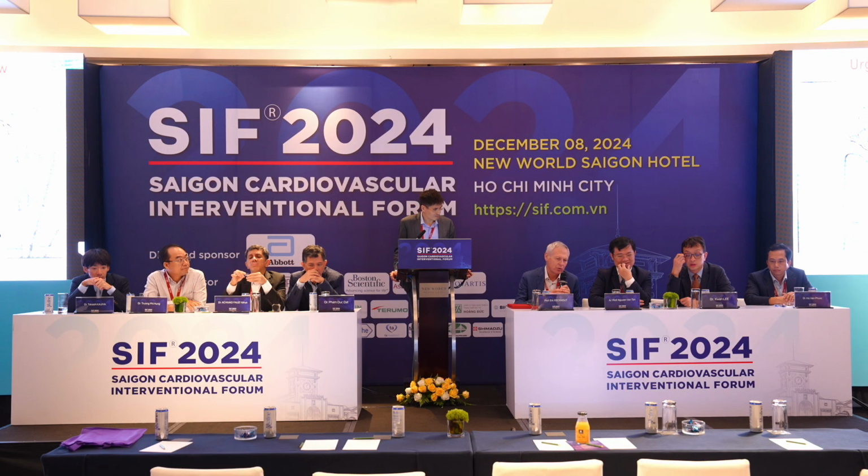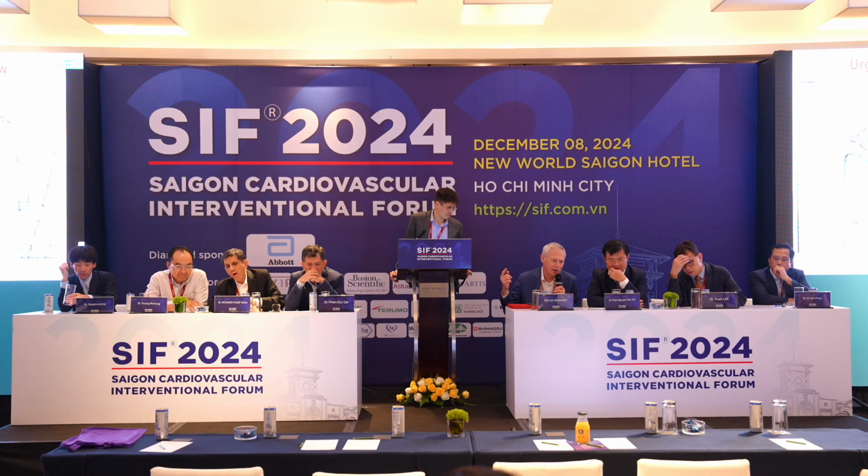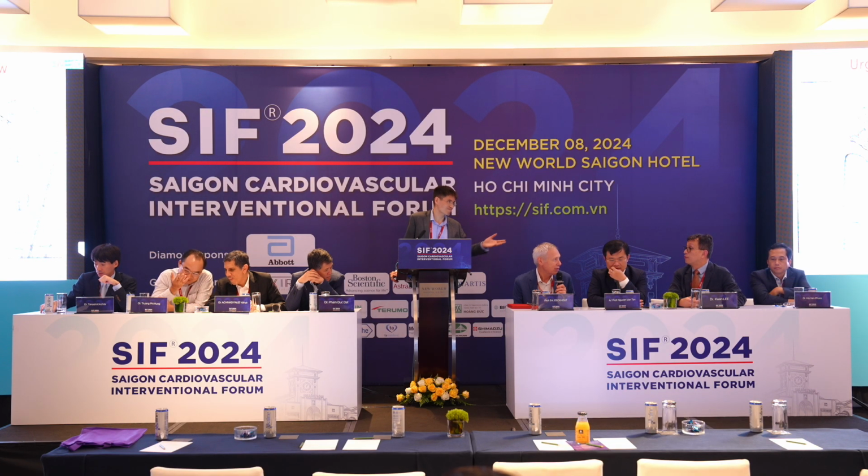I think absolutely you're right, Quan. The LV is on the other side, definitely in this view. And I also have seen fistula after TAVI from the aorta to the right atrium. So it also can happen. It's the same, yeah.